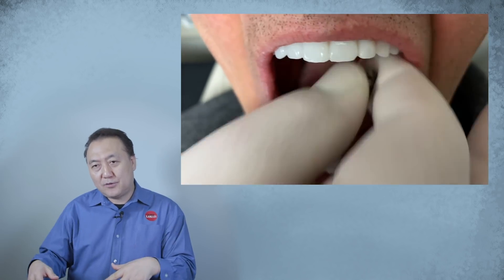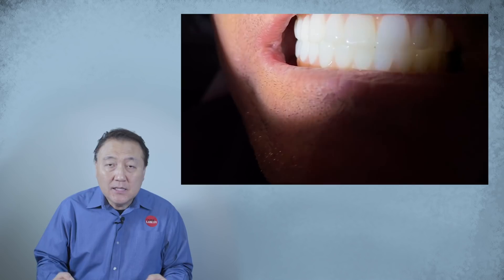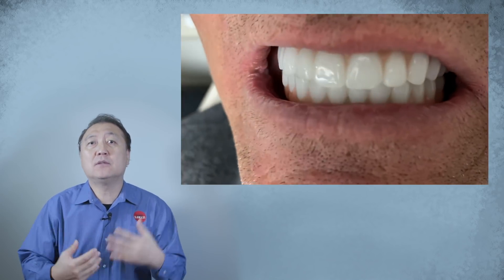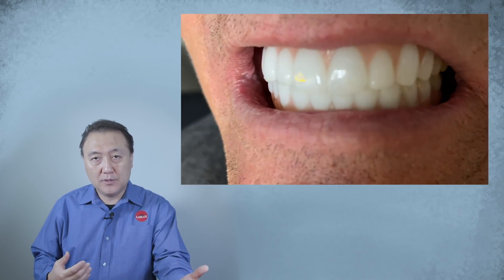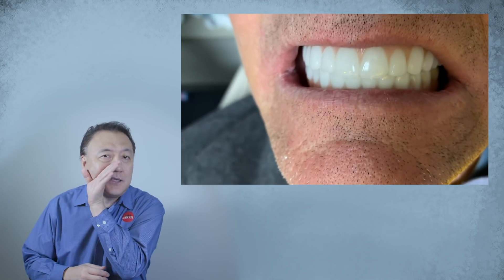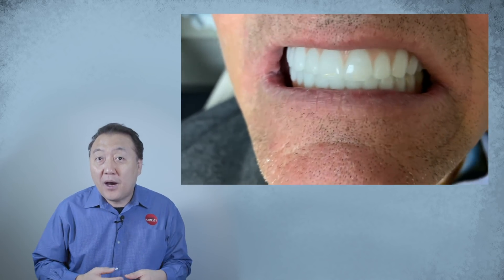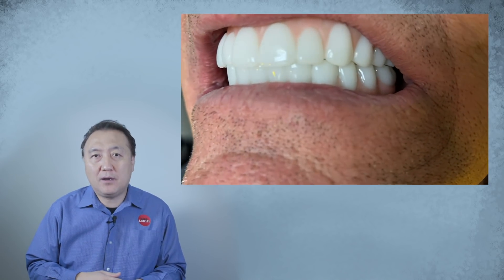Here are the cons. Whenever I make a printed denture and deliver it to the doctor, it's very rigid — they can't move anything, they can bite on it, and they can even wear it as a temporary for three to six months. The problem is when they say 'his bite is really off' or 'the midline is off' or 'one side is longer.' That's the challenge. But once we get the photos and everything, we just reprint it. That's the great part.